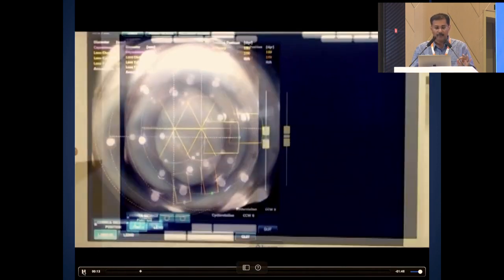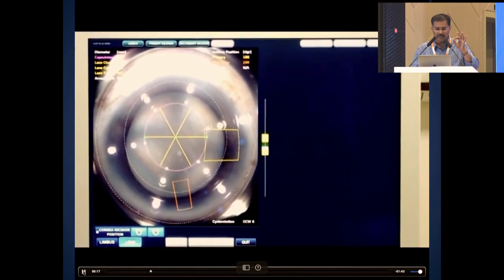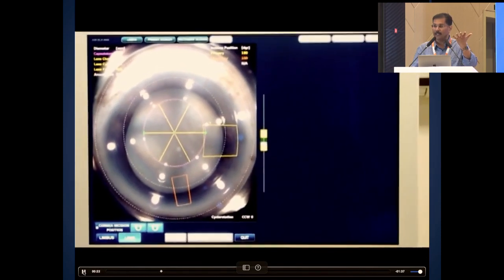But the main problem here, in the hypermature one, is that the area which gets completely cut first will let out the fluid cortex which is there.